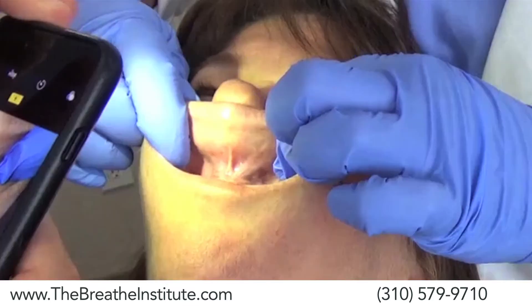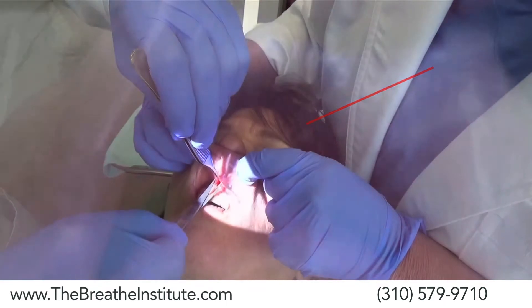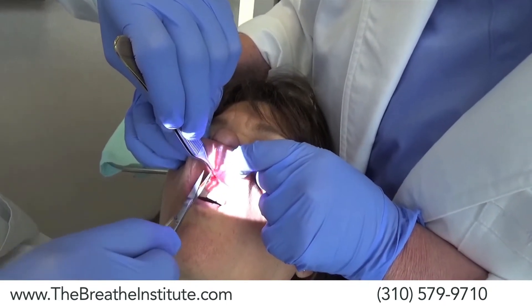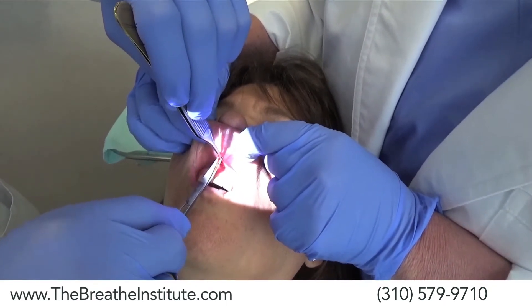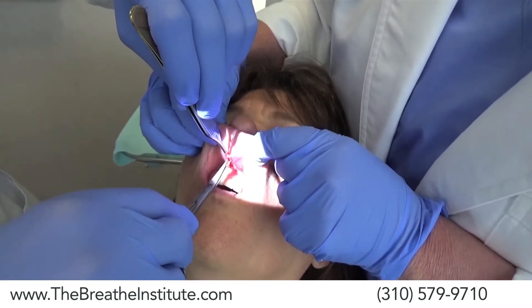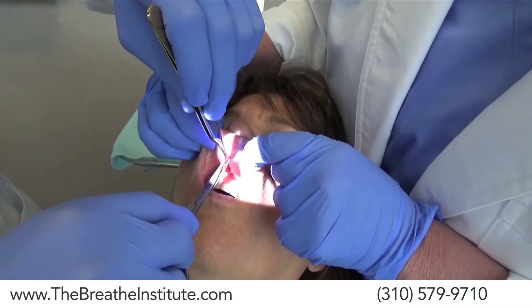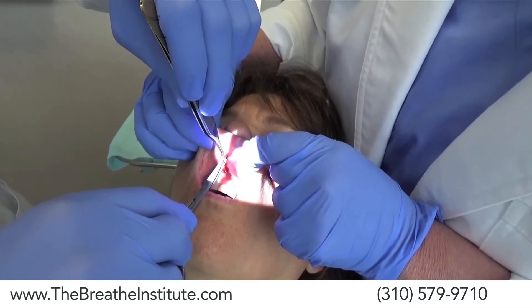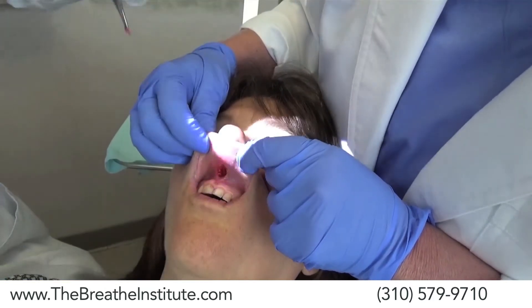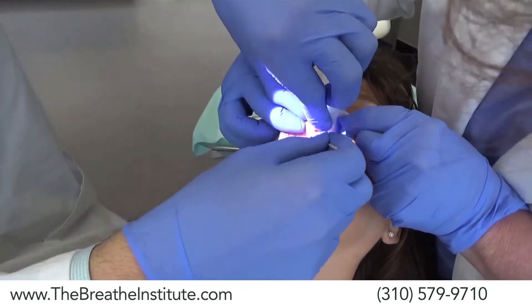The other procedure you will see is an upper lip frenectomy release. As you can see here, it's fully healed and the lip has not reconnected to the frenectomy. One of the ways Dr. Zaghi does this is by using surgical scissors to very cleanly and completely remove the frenum so that it does not regrow or heal tighter. Then he sutures it completely closed, and without having to open up any further, he's able to release even more connective tissue with a q-tip.